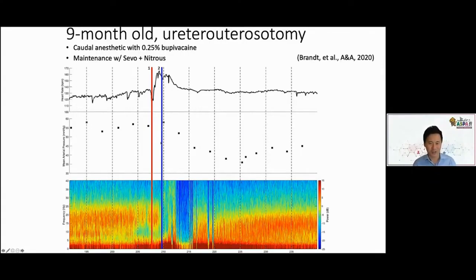And certainly this whole situation was avoidable if the EEG had been monitored, because early on you could see that the alpha wave was dropping out, and then eventually everything was shifting up to higher beta frequencies, which is a pretty clear indicator of a lightening, a recovery of consciousness. And this is transpiring over a period of minutes. So you could have definitely detected it if the patient was being monitored.